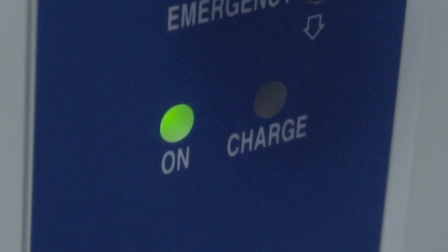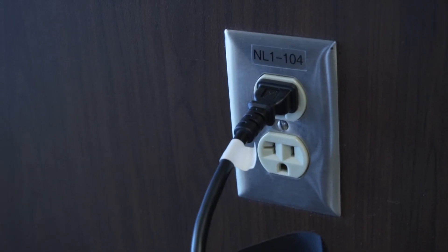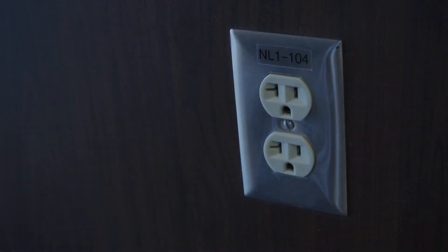For longest battery life, do not use the lift until the battery is fully recharged. Always unplug the cord from the wall outlet before moving the lift.